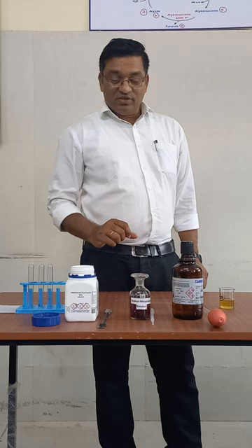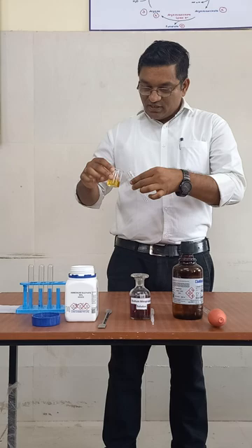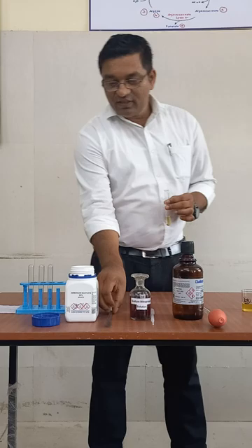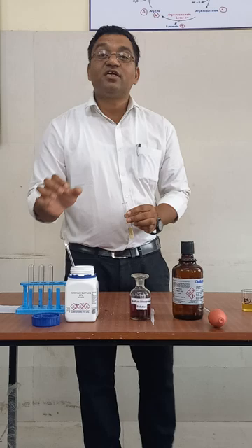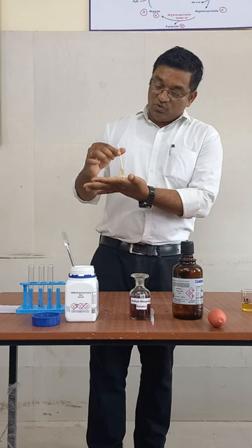Take 3 to 5 ml of urine in a test tube and saturate this urine sample with ammonium sulphate powder. Ammonium sulphate causes the precipitation of proteins and concentrates the ketone bodies at the centre of the solution. Shake it gently.